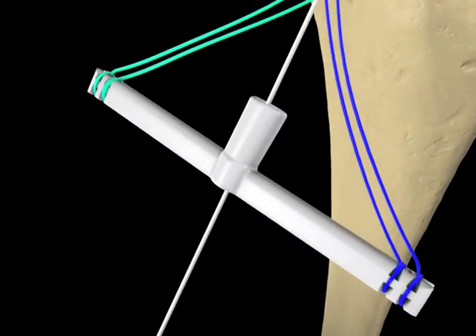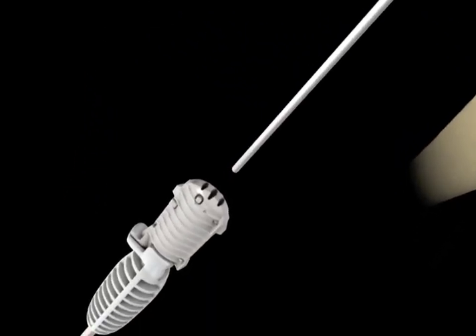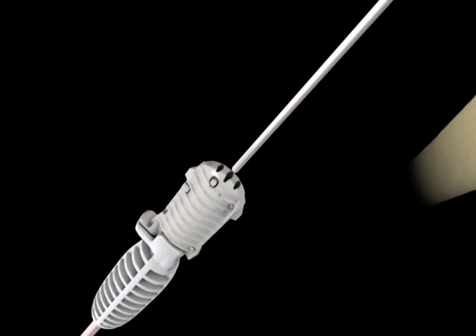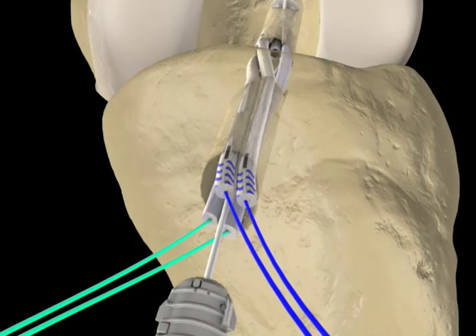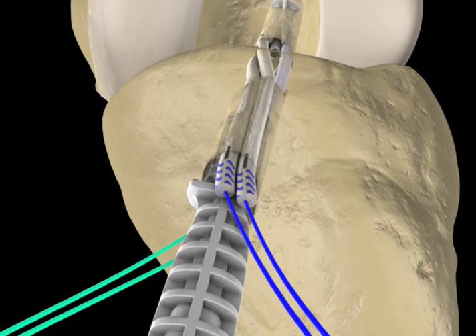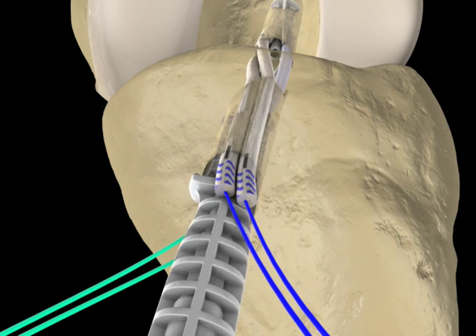The inserter is preloaded with the sheath holder and the tibial sheaths. The inserter, sheath holder, and tibial sheaths are fed over the guide wire into the tibial tunnel and inserted until the cortical engagement tabs are fully seated against the tibia in the 12 o'clock position or 9 o'clock in a left knee.